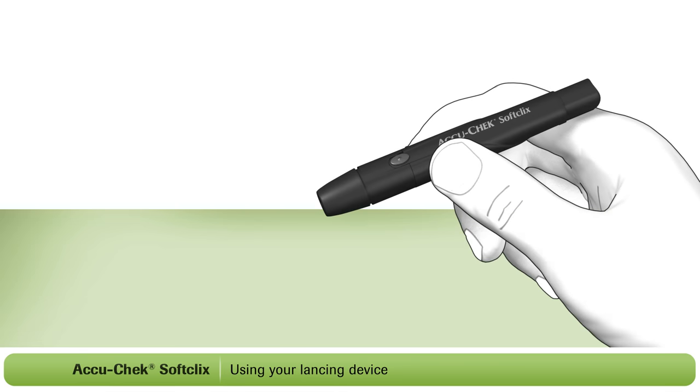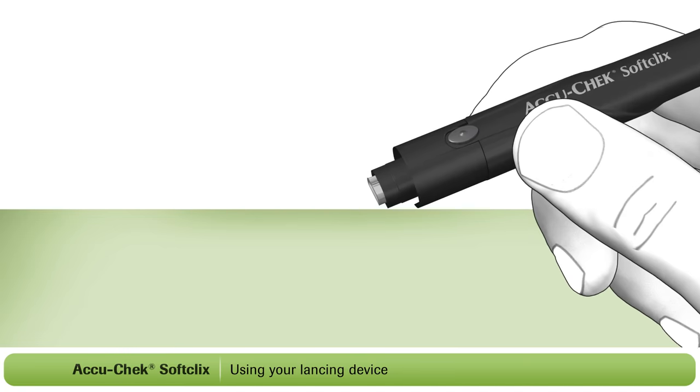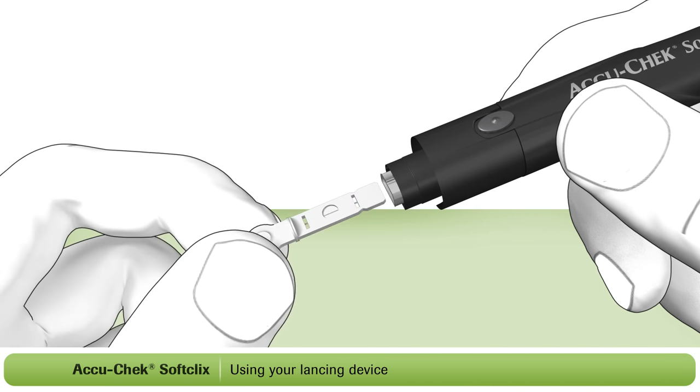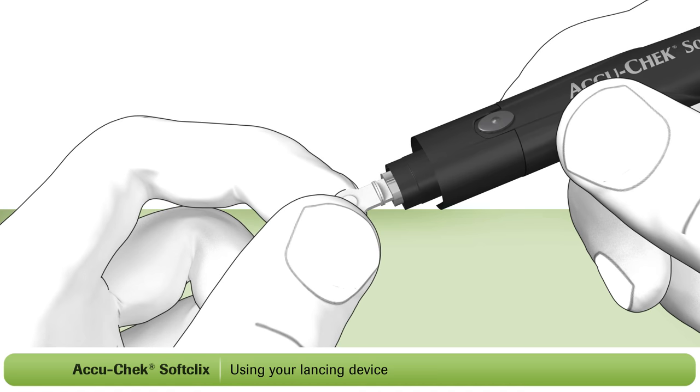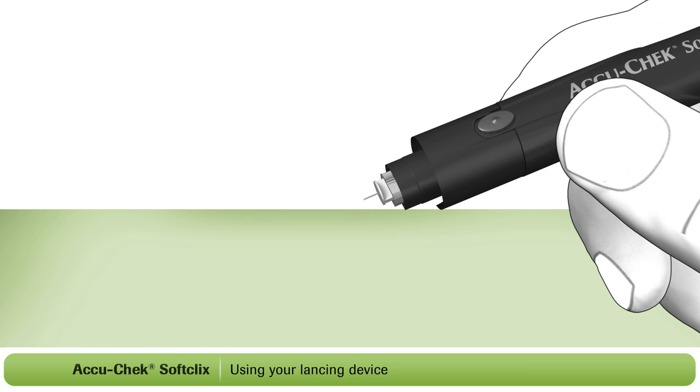Remove the cap from the lancing device. Now insert the lancet into the lancet holder as shown. Push it all the way in until it clicks in place. Twist and remove the protective cap from the lancet to expose the needle.